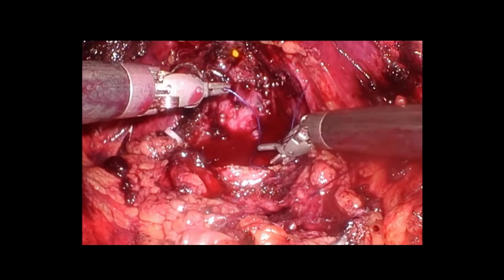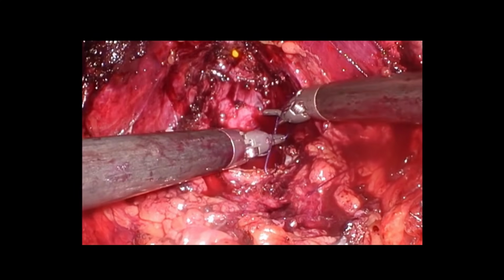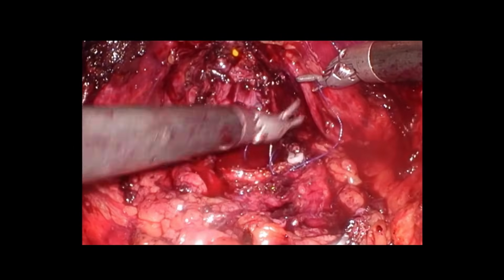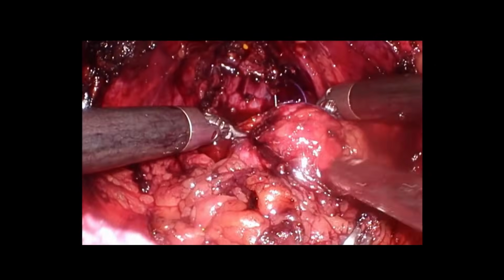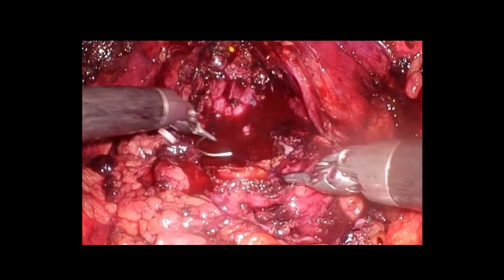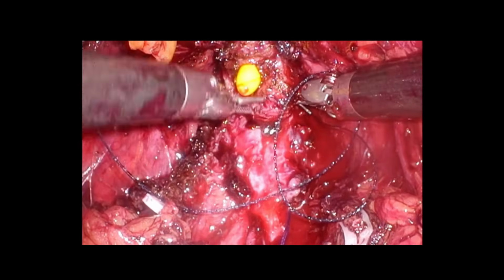Closure is done. This is a fish mouth closure of the bladder neck. With a tennis racket closure, sometimes it is difficult once you go to the anterior wall of the urethrovesical anastomosis. So the fish mouth gives a good caliber urethra, and the visualization during the reconstruction or the urethrovesical anastomosis becomes easy.